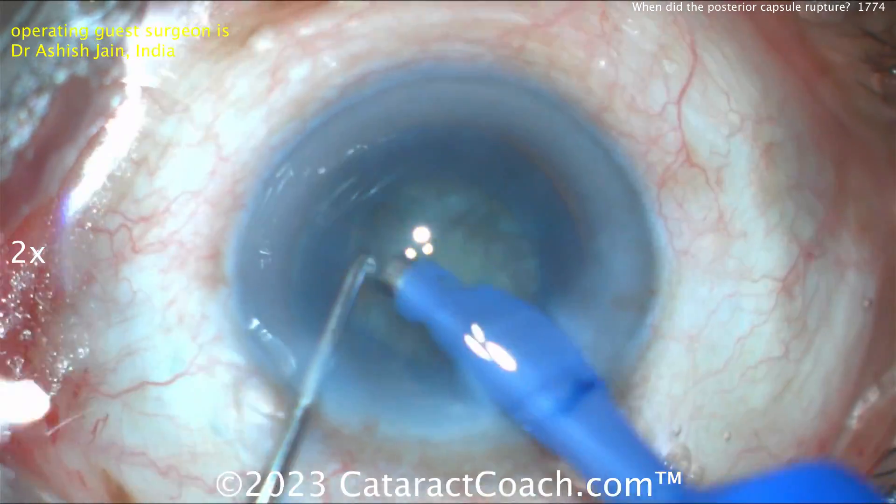We've sped the video up, but you want to do this vitrectomy on the slow side — do not rush it, it takes time. You can see the capsule coming back as you take that prolapsed vitreous out — whatever remnants are left of the posterior capsule come back into the central part. When you do this, be very cautious not to damage the anterior capsule rim — you need that because we want to get that optic capture done.